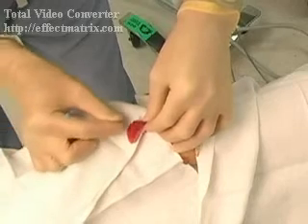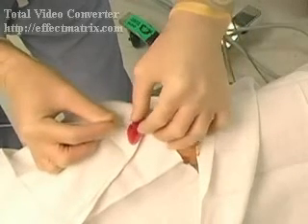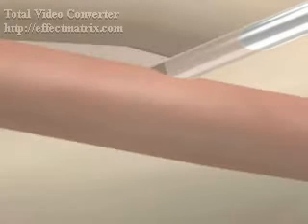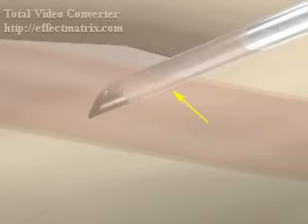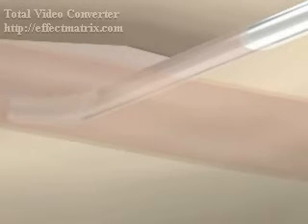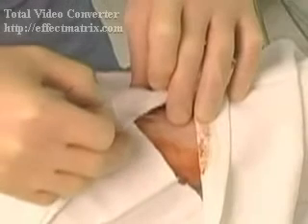Occasionally, free flow of blood is observed, but the catheter will not pass easily. In the animation, you can see how the tip of the needle might be within the vessel, while the catheter remains outside. By advancing the needle slightly farther after the initial flash of blood, the catheter can enter the artery, allowing for successful cannulation.